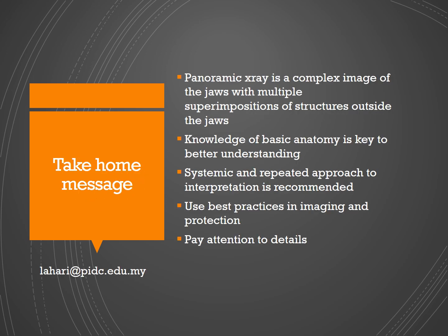So the take-home message is: a panoramic X-ray is a complex image of the jaws with multiple superimpositions of structures outside the jaws. Knowledge of basic anatomy is key to better understanding. A systematic and repeated approach to interpretation is recommended, use best practices in imaging and protection, and pay attention to details. So that was about panoramic imaging. If you have any doubts, please feel free to contact me and I would be happy to clarify them for you.